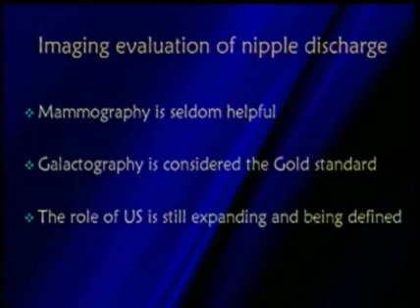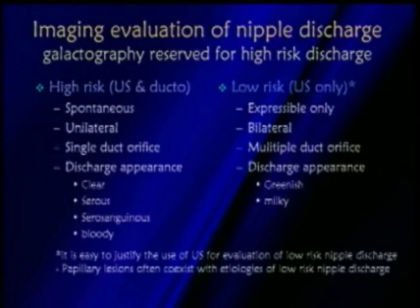Mammography is seldom helpful in evaluating nipple discharge. Galactography is considered the gold standard, but the role of ultrasound is still expanding, and we are going to define it a little bit better today. When we image patients for nipple discharge, galactography typically is reserved for our high-risk patients.